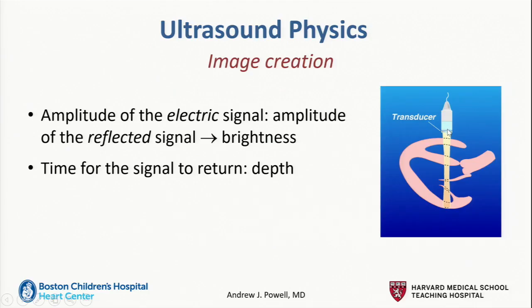So if you think about it, if it sends out a sound wave pulse and then stops and just listens, that signal that gets reflected back sooner is coming from the closer tissue to the transducer, the near field, and the sound waves that are coming back later are coming from the far field or further away.